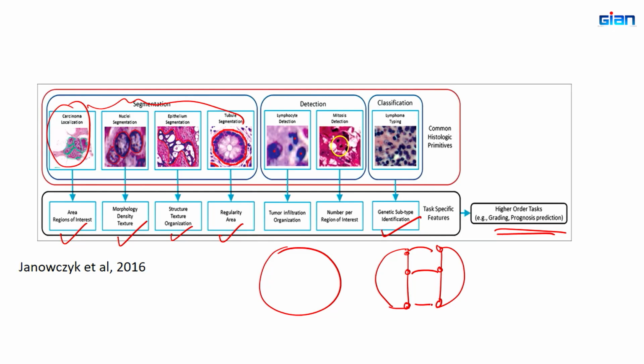So, you have something called a homography matrix. You compute the homography matrix and then multiply it with the image, and it brings that to the same coordinate space as the first one. That is how you stitch images. Image stitching is a big field. In fact, all of you have it on your phone. What application on your phone camera has image stitching? Anyone? The panorama mode, right.